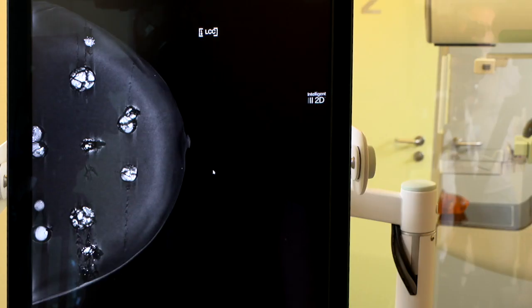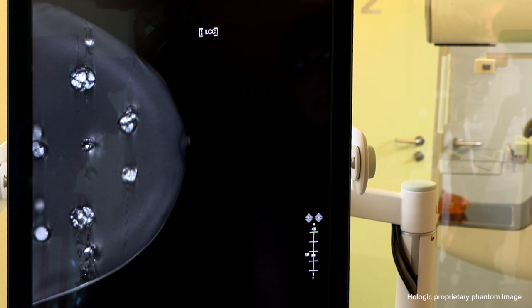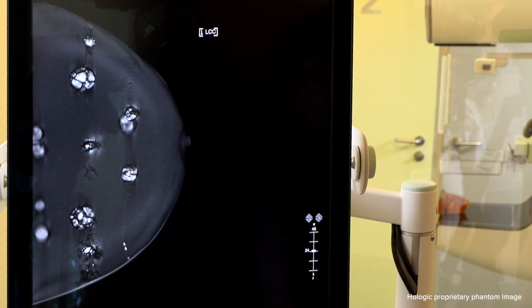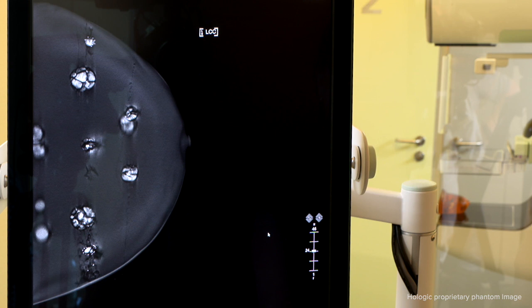If I then click on this button here I can go through the tomo slices, so I can just scroll through the breast and find the area of interest. For instance, looking at these micro calcifications here, I know that these micro calcifications are at level 24. Using tomo HD, which is the 3D and the synthetic 2D, we actually reduce the radiation dose by 45 percent to the patient.